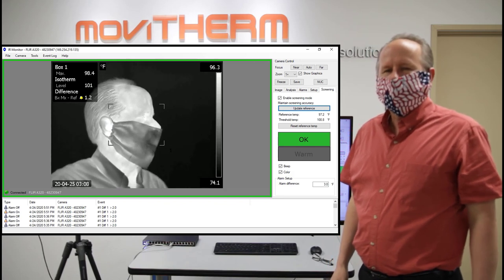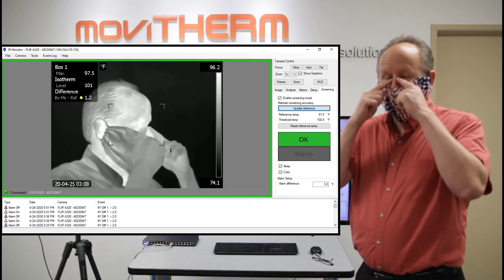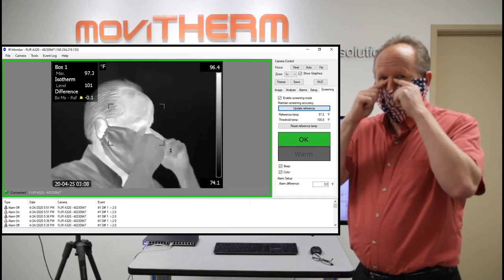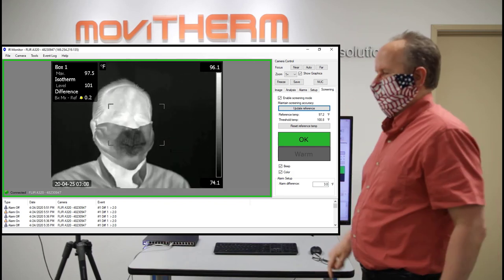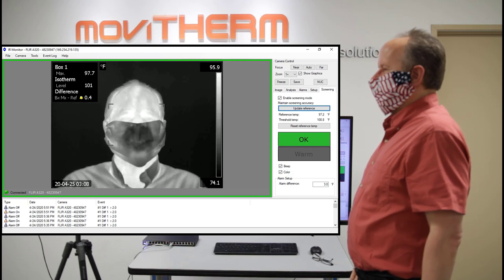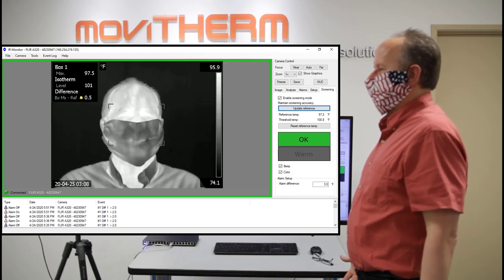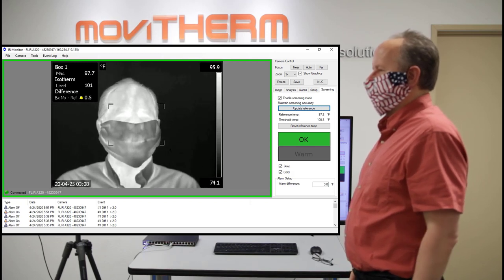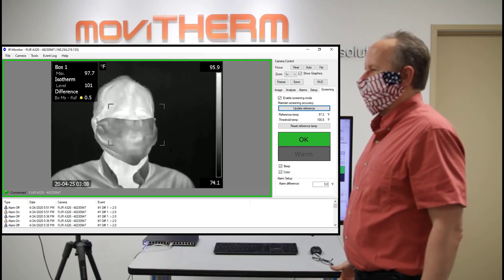and since I'm healthy, I don't have an elevated body temperature, the software here shows a green frame and a green OK sign.